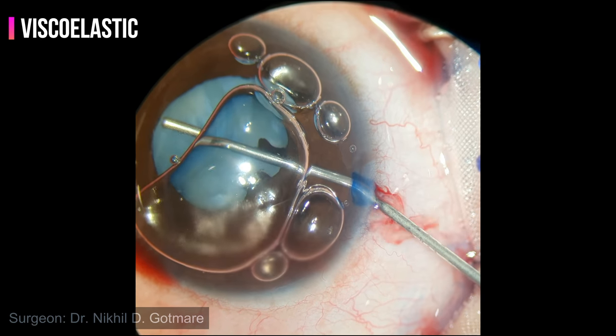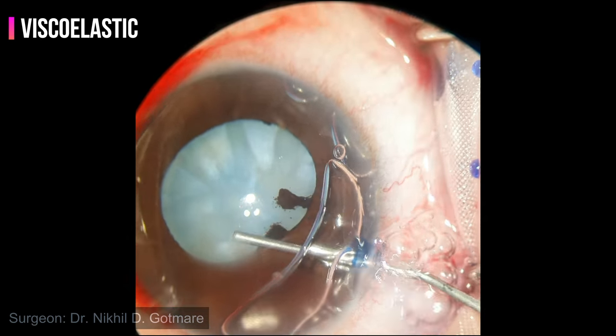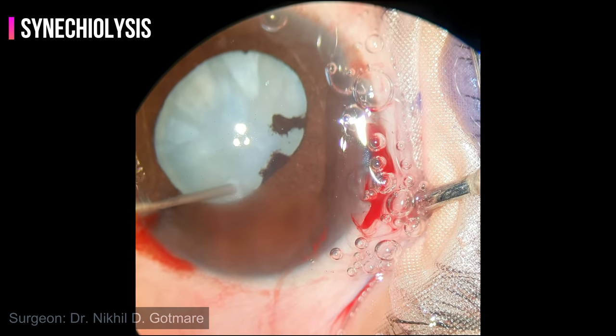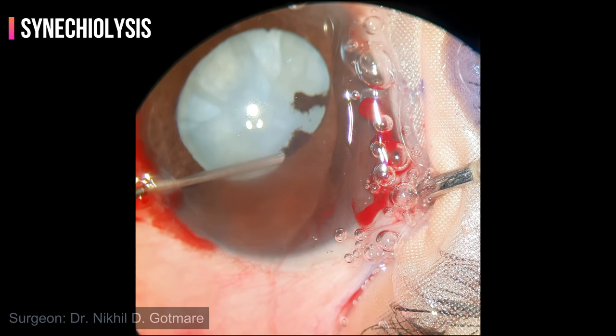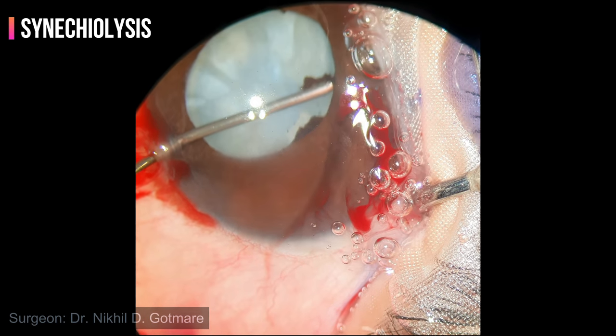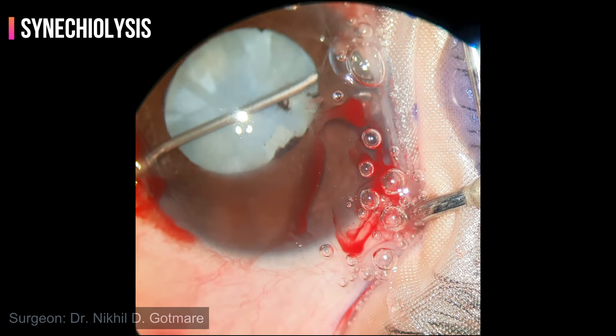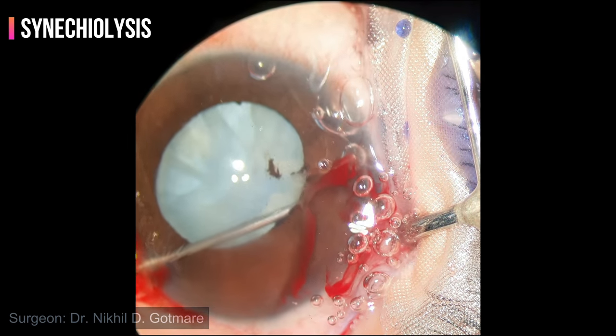The anterior chamber is formed with viscoelastic. Using the same blunt viscoelastic cannula, gentle sweeping motions are done on the undersurface of the iris to release the synechiae, taking care not to damage the anterior capsule.